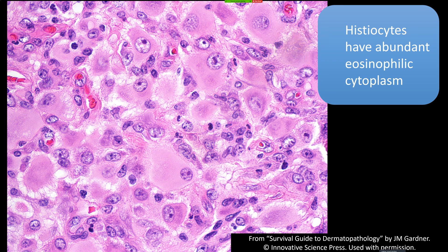Oftentimes the cytoplasm of these big dense pink histiocytes has a kind of two-toned — not to be confused with Touton giant cells, but a double-toned — color. They have a more purpley or lavender area in the middle and then a more pale pink towards the outside. It's a little hard to get a good picture of, but once you recognize it, it's a very distinct look that these histiocytes have.